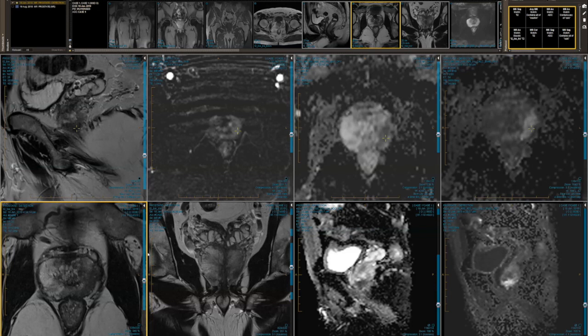I think we do more time. It takes us about 40 minutes. It's quite a long scan. We got somebody in to take a look at our scans to try and increase the quality overall, and they wanted to add a couple of minutes to the sequences, and our radiographers threw their hands up in horror. Like everyone else, we're really tight for time.